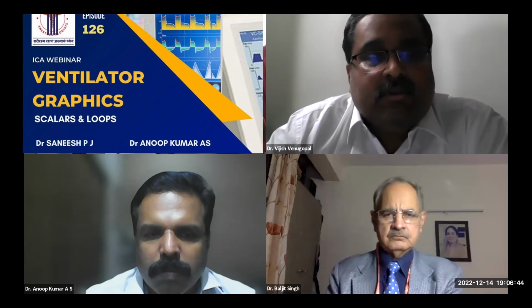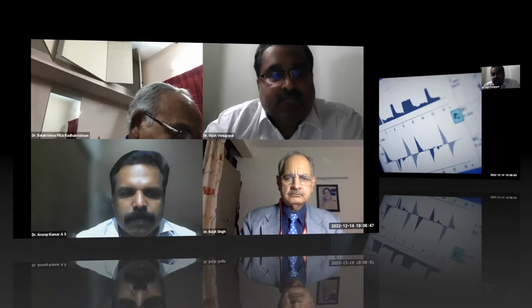So today we will be discussing a topic on ventilator graphics.